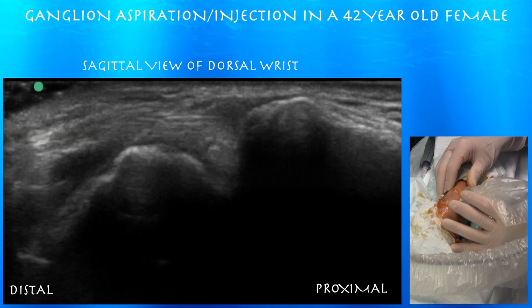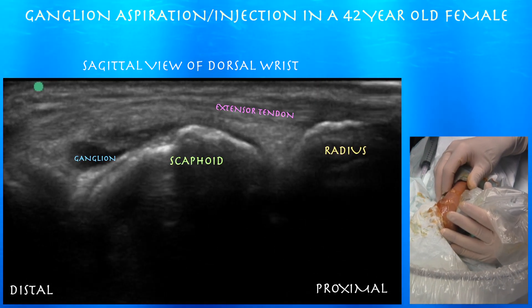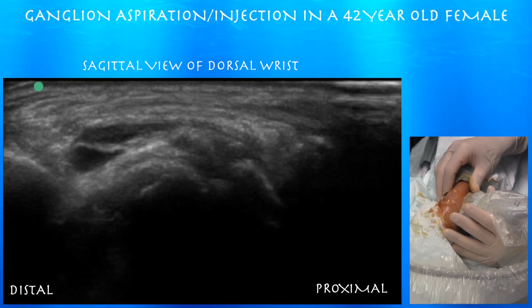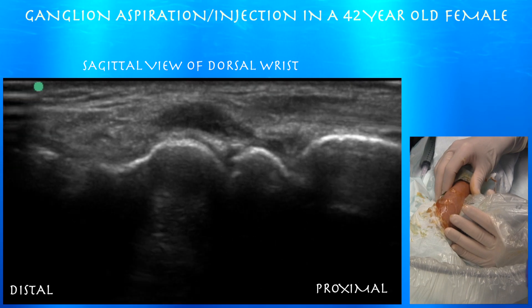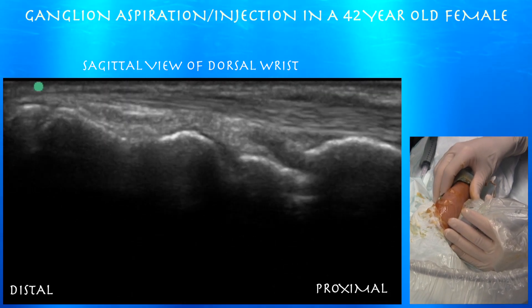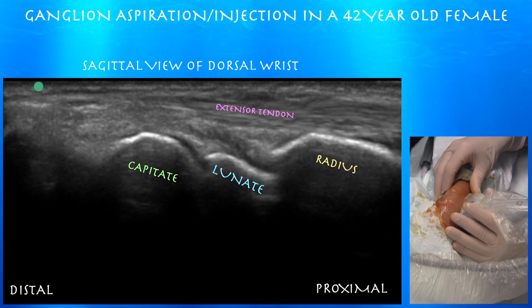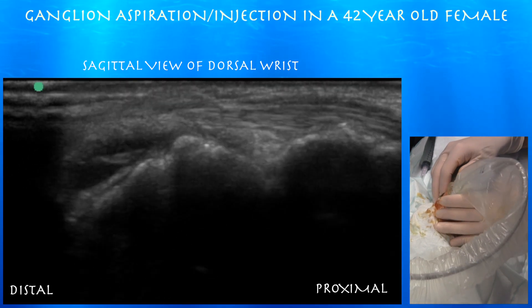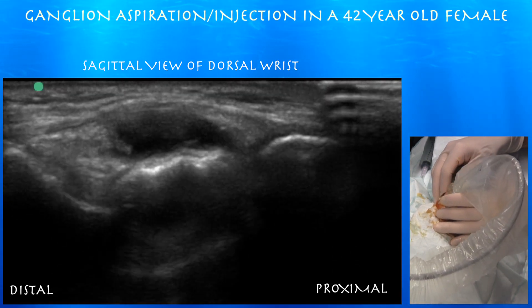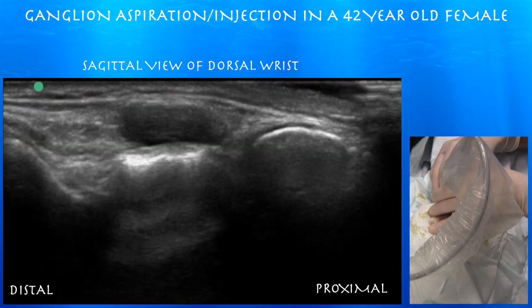Starting from the first extensor compartment and going a little bit ulnar, here we are looking at it in a sagittal perspective. You can see the extensor tendon over the radius, the scaphoid, and other extensor tendons. Going more ulnar, you can see the articulation of the radius to the right into the lunate, and then the lunate into the capitate on the left side of the screen. You do not see this fluid communicating with the joint, so it's not an effusion at the articulation between the scaphoid and the distal radius, as occasionally you can see expansion of the dorsal recess of these joints.